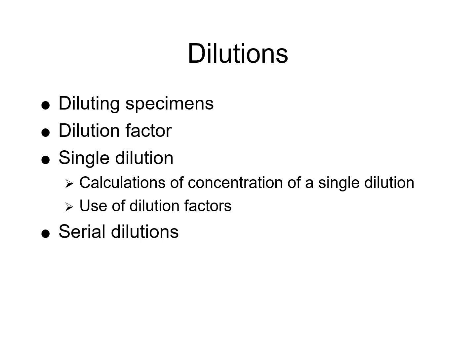For serial dilutions, we have a stepwise dilution in which the previous dilution is further diluted. The purpose of a serial dilution is to determine endpoint titers in antibody testing. It helps to ensure accurate measurement of highly concentrated specimens. An example is you would have a 1 to 2 dilution, which would then go to a 1 to 4, a 1 to 8, a 1 to 16, and so on.